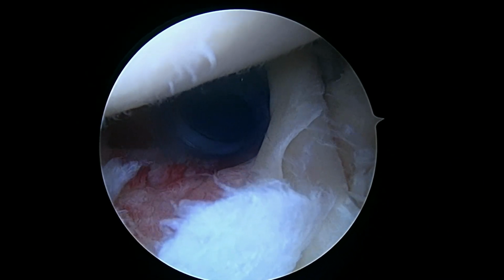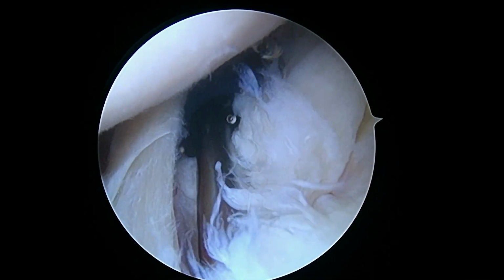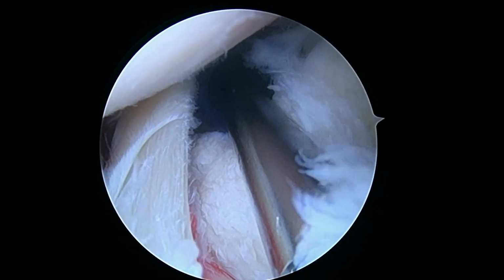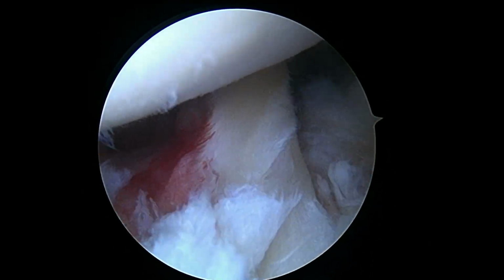I'm going to put in a shaver just to use more as a pointer. But this is your biceps to the right of the shaver. To the right of that is this really big tear in the rotator cuff tendon. We'll go ahead and turn on the shaver and get that spinning in just a minute. But while we're getting that done, we'll have a look at the rest of this.